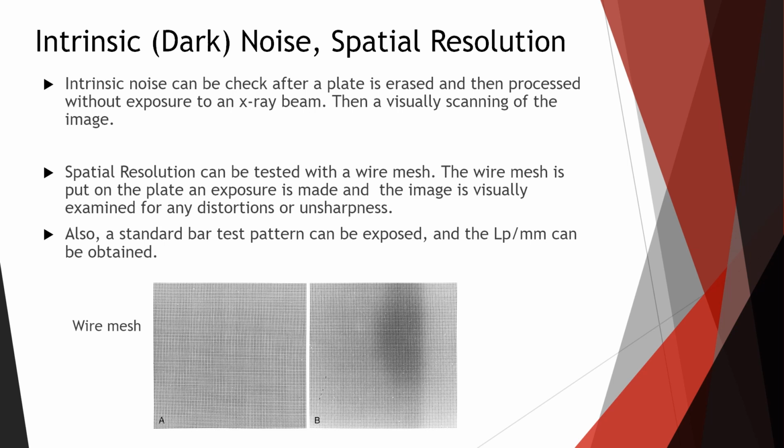This is an issue with the spatial resolution. So in this area, there's some kind of blurring. It's either with the plate, it's either with the image display, it could be with the processing. So there could be a lot of things going on here, right? All these things make up the spatial resolution in digital. Okay, digital being CR or DR, radiology.